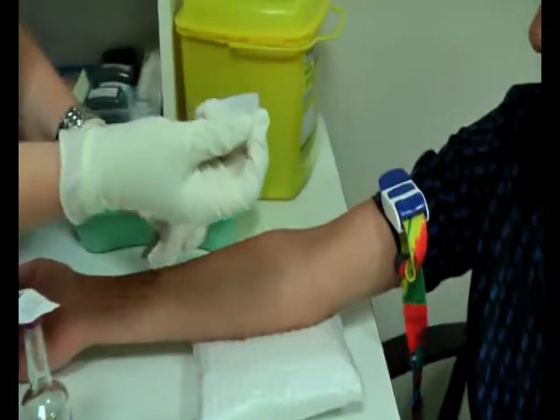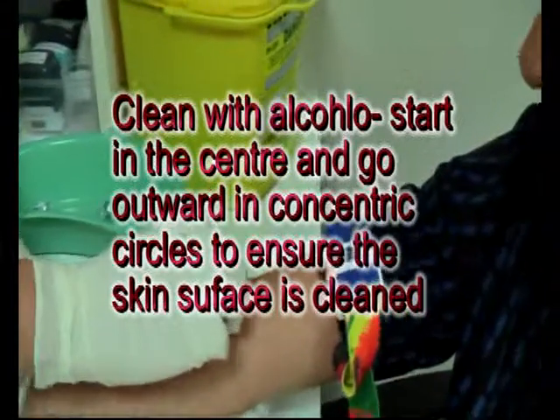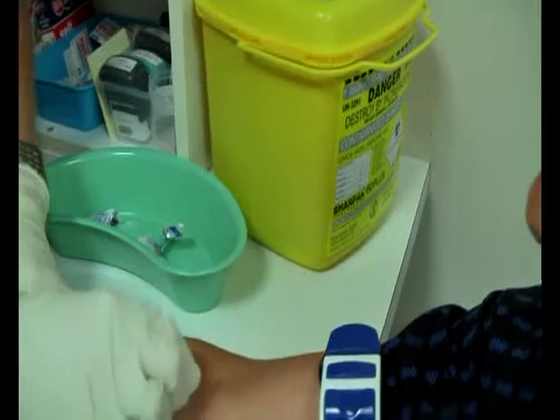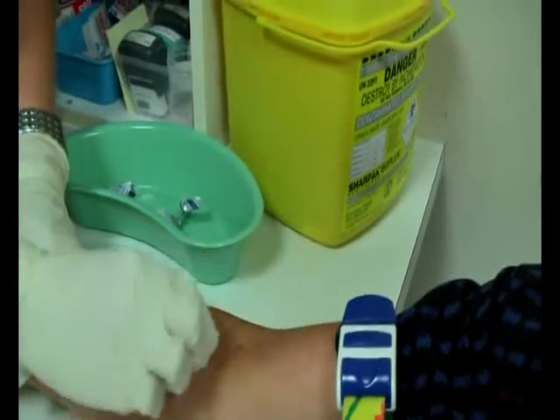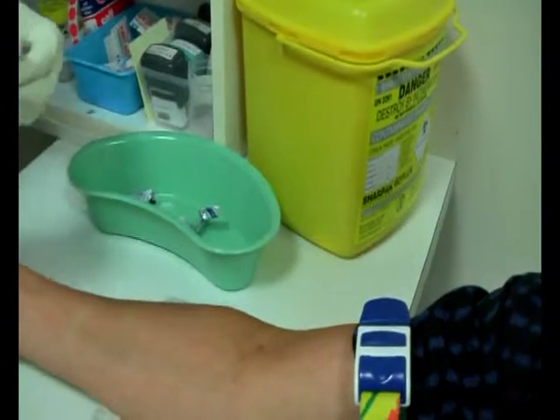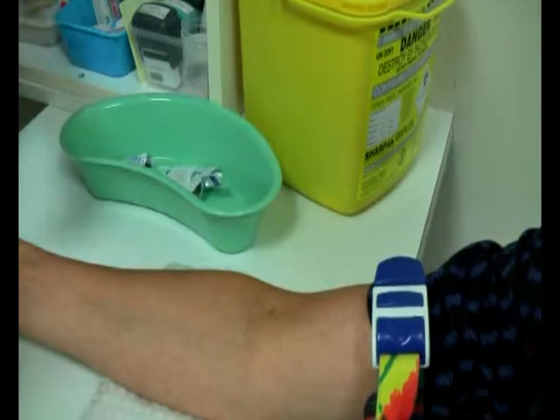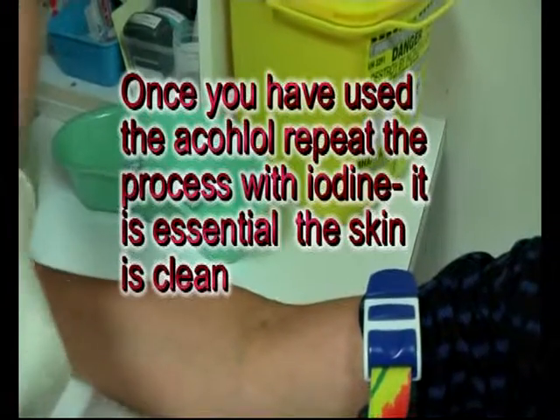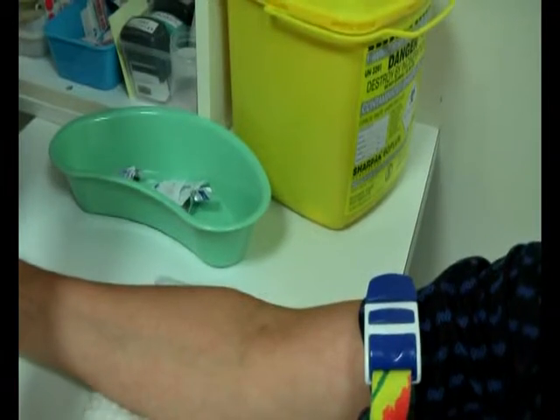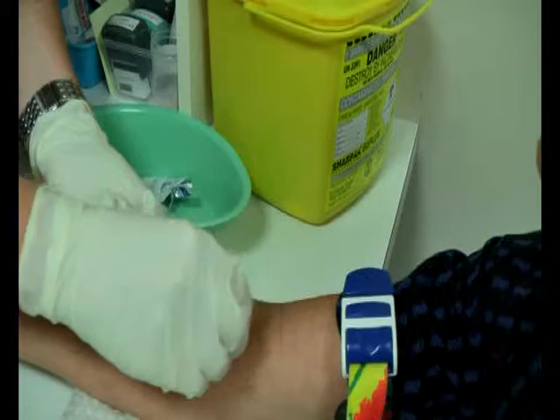Clean your patient's arm with some alcohol. Start in small circles and gradually get bigger for 30 seconds. We're then going to clean the arm with some iodine. Same technique, and again for 30 seconds.